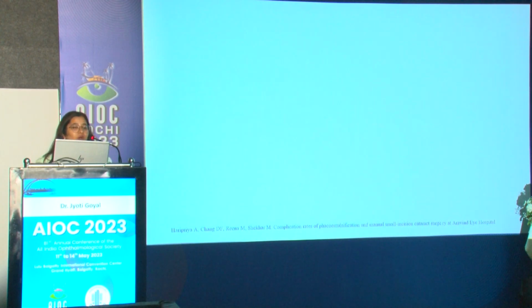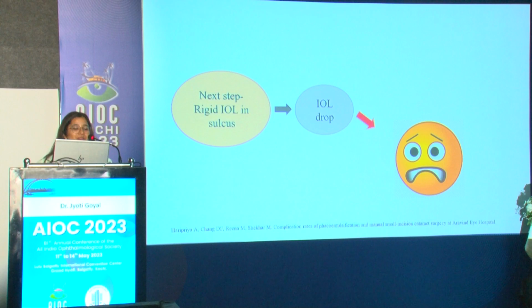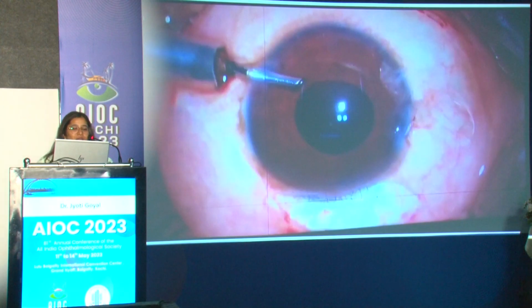So why am I talking all these big numbers is because in my study, I have addressed these complications and worked upon a solution, a technique which is simple, stable, for well-centered placement of IOL, and it also prevents one of the most dreaded complications of any cataract surgeon, that is the IOL drop. So this is a video where I will be showing how this technique is used.